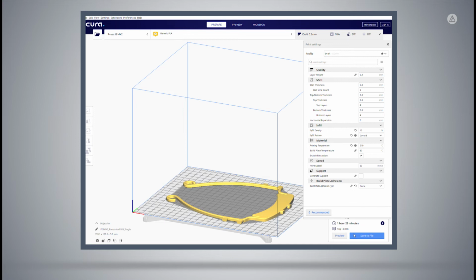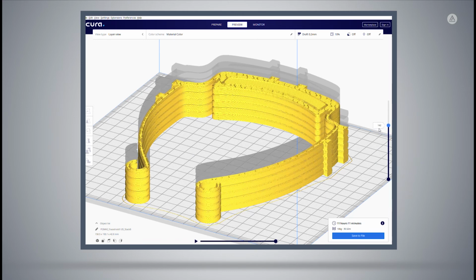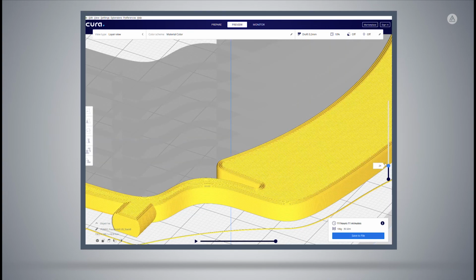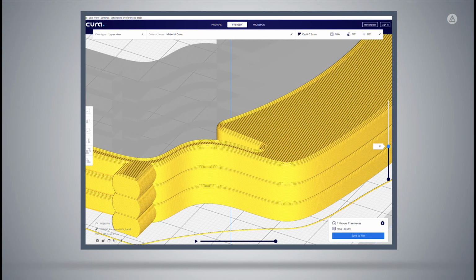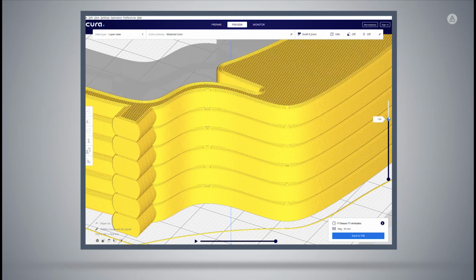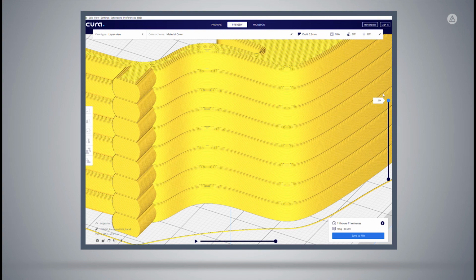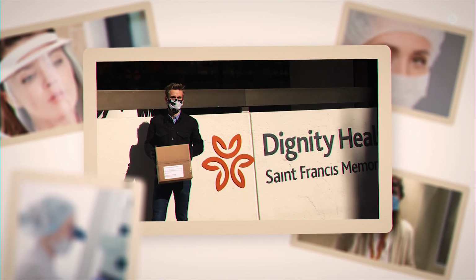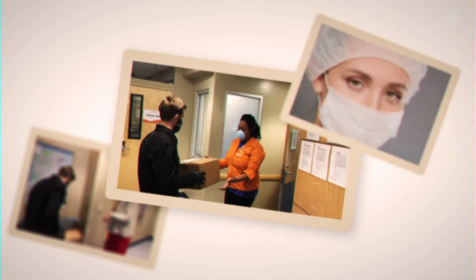If you get the single frame to print consistently and you'd like to increase your production, you can print stacked frames. Go ahead and download that file from our site. The same part is repeated vertically with one layer thickness between each part and a vertical tab to keep the temples together. It's important that you keep your layer height set to 0.2 millimeters here, otherwise the frames will fuse together. Leave the support turned off unless you have a dual material printer, in which case printing with soluble supports can be helpful. Each one that you create will make a world of difference for the people using it in the field. Thank you so much for stepping up to help us flatten the curve right here in the Bay Area.